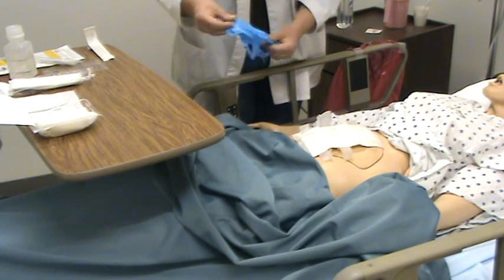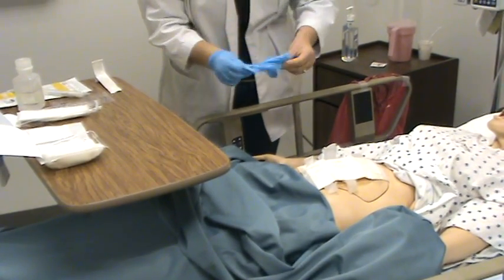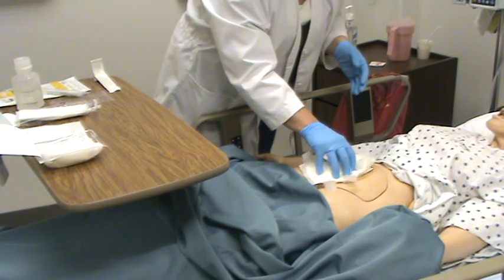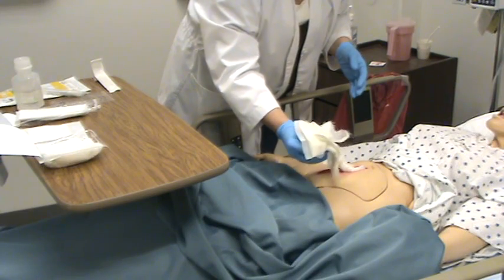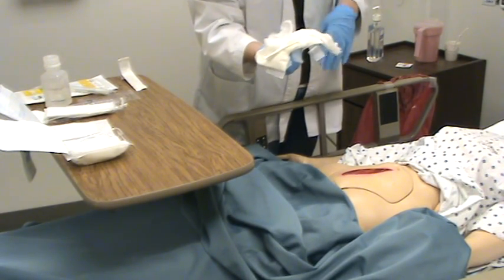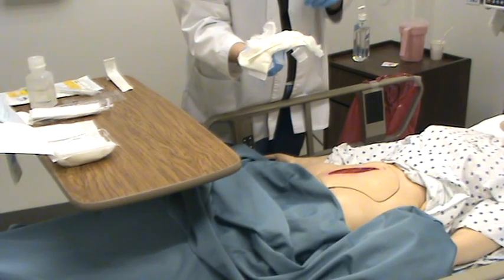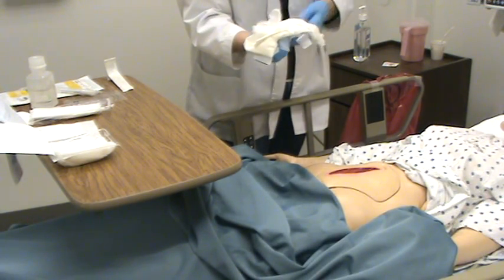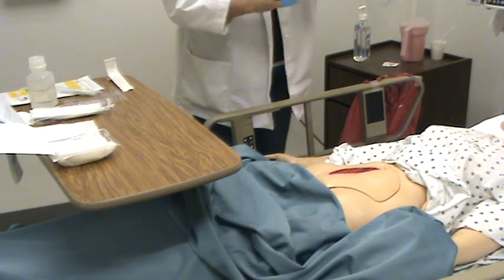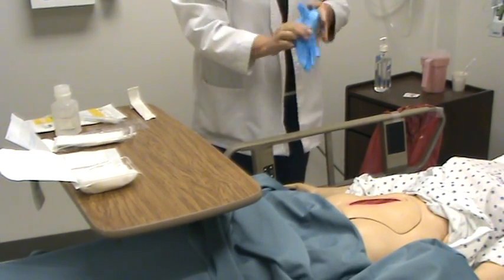Now I'm going to put my clean gloves on and I also have my biohazard bag ready to go, and I'm going to take the dressing off. I want to make sure I look at the dressing: Type, Amount, Color, Odor — TACO. What type of drainage is on here? What color is it? Does it have an odor? Don't stick your nose in there but see if there's an odor when you take it off. If you're describing the amount, you can say a certain amount is saturated, or use coins or fruits or any type of universal size so everybody knows. I'm going to take my gloves off with the dressing inside to keep it contained.